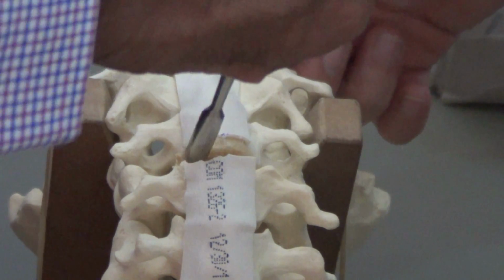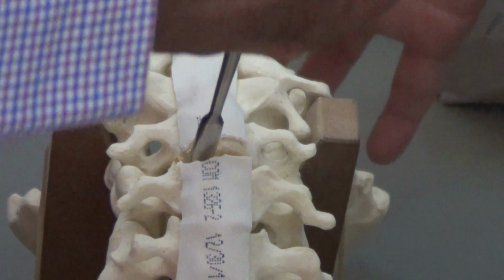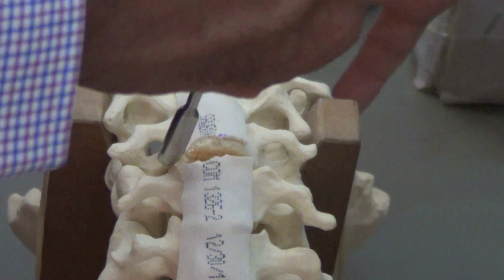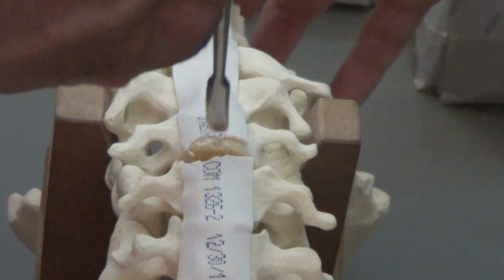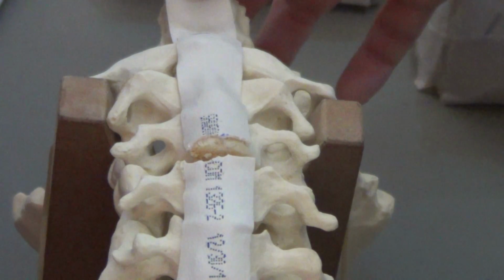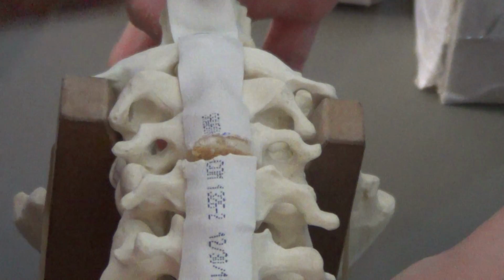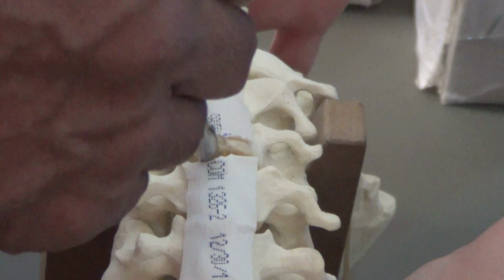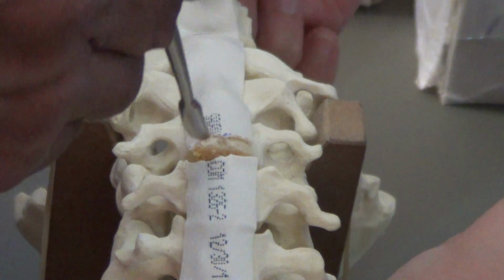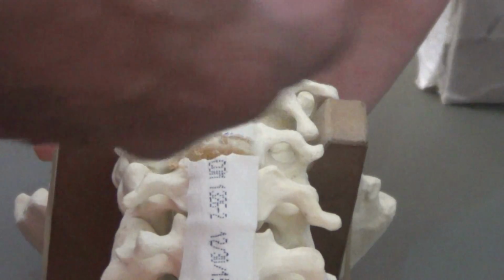If you go too laterally, what is the vessel that is running there? The vertebral arteries are there. So if you go lateral to the uncinate process, you are in danger of injuring the vertebral artery. So you burr and straighten so that you have a nice raw area, but do not take out the cortical bone till you come to the cancellous bone. Then there will be collapse of your bone, or if you are using a cage, there will be a collapse of the cage. So after you have burred or straightened it, then you tackle the posterior longitudinal ligament and see where the disc has prolapsed. Take out the small prolapsed disc.